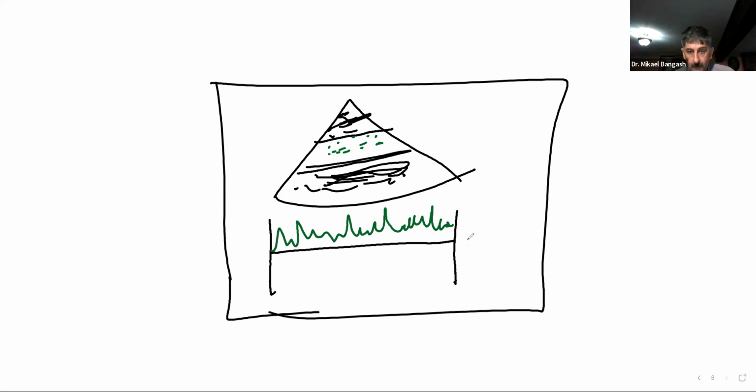Now you will see here this says 0. So this line here indicates 0, ideally, unless we play around with it and change some settings on the system. Anything above the baseline, or the 0 line, is going to be positive Doppler shift, whereas below the baseline is going to be negative Doppler shift. So in this case, we have a positive Doppler shift.